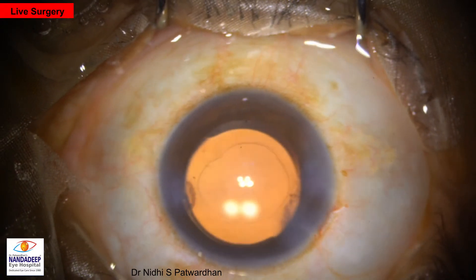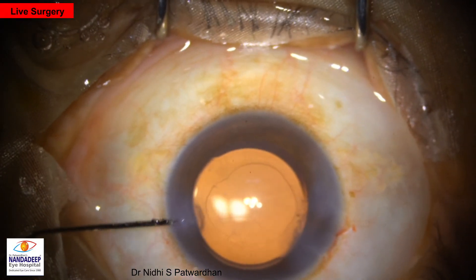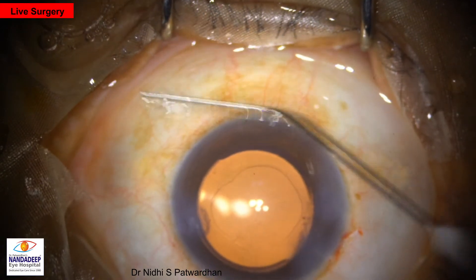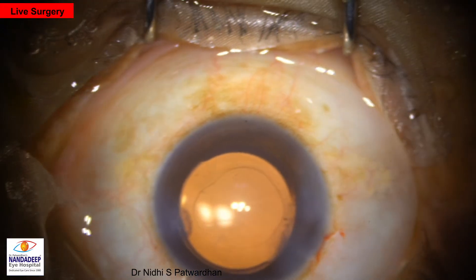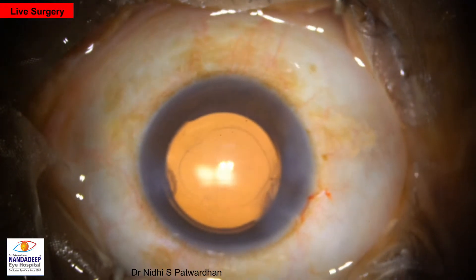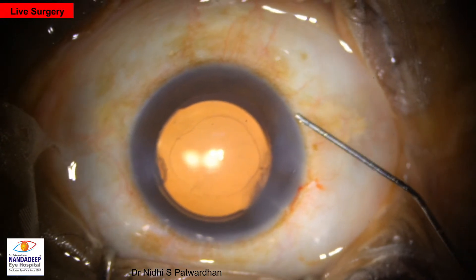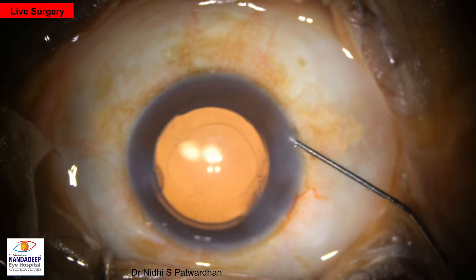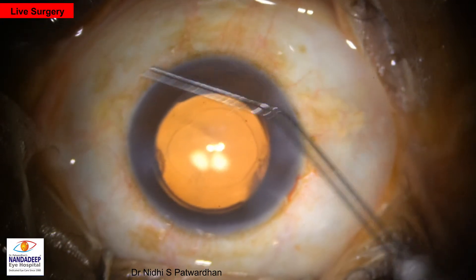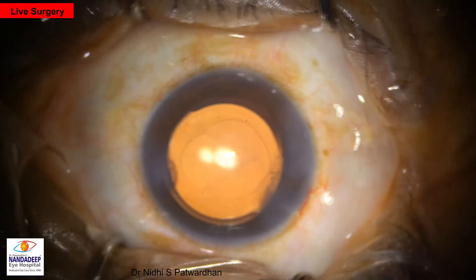This is the last part — hydration. The outer parts of the incisions are hydrated. Make sure that the anterior chamber is well formed at the end of the procedure. Surgery was done on topical anesthesia, the patient is comfortable, the IOL is well centered, and the rhexis is overlapping the IOL. The last step is injection of diluted moxifloxacin — we use 50% dilution and inject around 0.1 cc. Finally, we ask the patient whether they can see the light, and that is the end of the procedure.